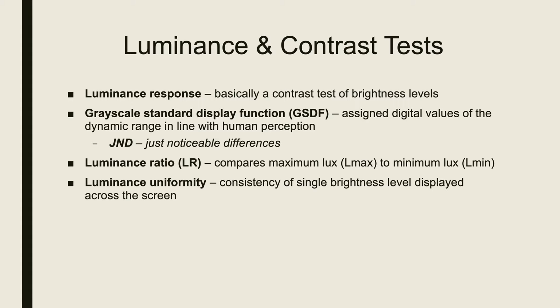The luminance ratio compares the maximum lux to the minimum lux, and luminance uniformity is the consistency of a single brightness level displayed across the screen. So it's just the uniformity of the brightness in your screen. Again, these are definitions. All you need to know is the definition.